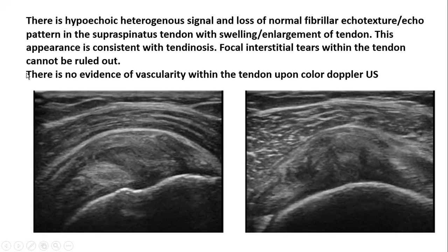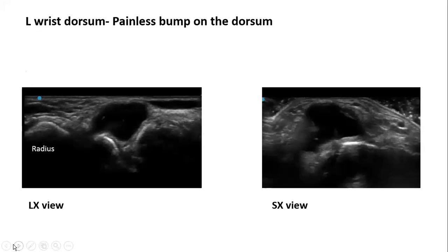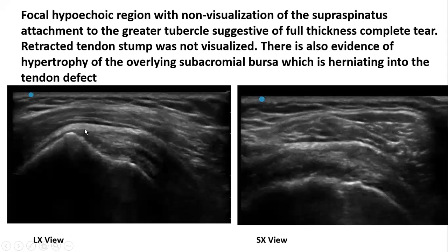Do you remember the first case, the last case I was telling you about? Okay, let's go back there. Remember I was telling you, if you see this part, the bursa, which is from GT to proximal, if it's linear and flat like this, you're questioning whether the tendon is intact or not. See the bursa here? So this is muscle, right? Yes. Right under the muscle is the bursa. So this interface is the bursa, and it's flat. It's not rounded, right? And even in short axis, can you see how flat this is? It's linear. It's flat here.